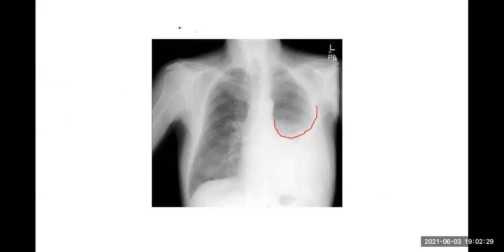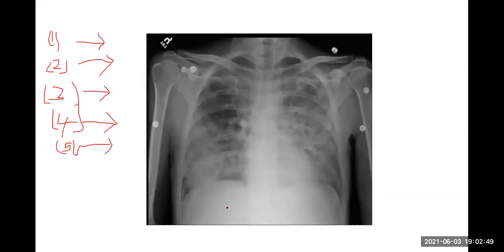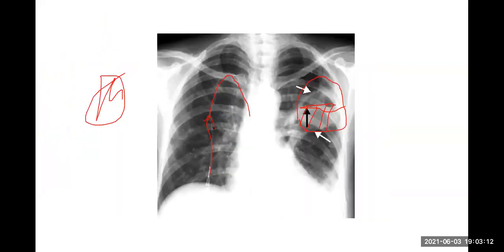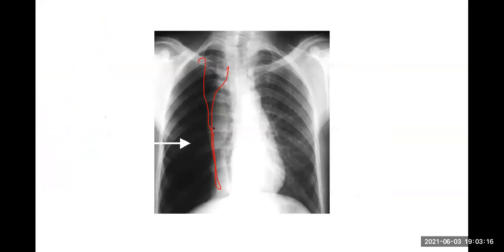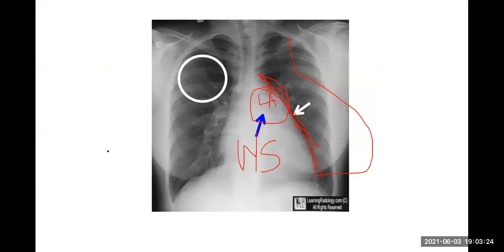So chest X-ray ABCDH: Airway, lung fields, bones and blood vessels, heart border, cardiac, diaphragm and hilum. In the lung fields, you have white lesions and black lesions. White lesions: pleural effusions, hydropneumothorax, consolidation, collapse, pneumonectomy. Wedge-shaped infarctions. Patchy white shadows could be due to bronchopneumonia or something like COVID, pulmonary hemorrhage, ARDS, pulmonary edema. Then small nodules, reticular nodules, large nodules, multiple large nodules, abscesses, bronchiectasis, and then we went on to the black lesions. Hilar lymphadenopathy, cardiomegaly and straight left heart border. These are the important ones.